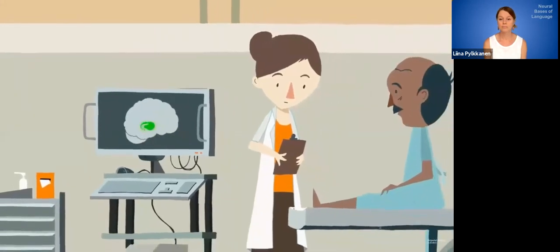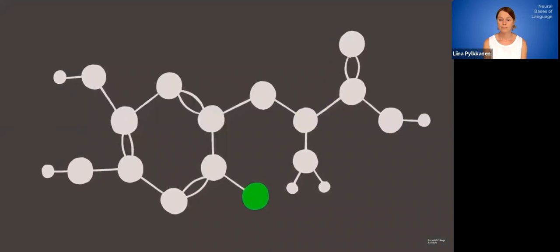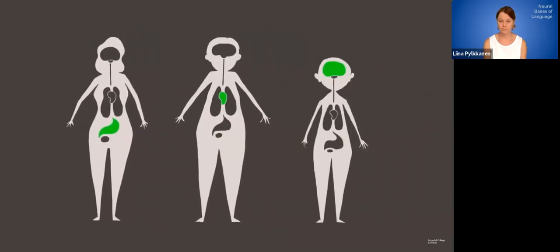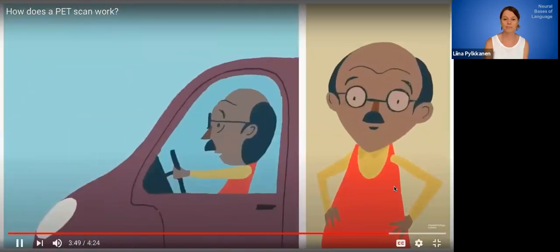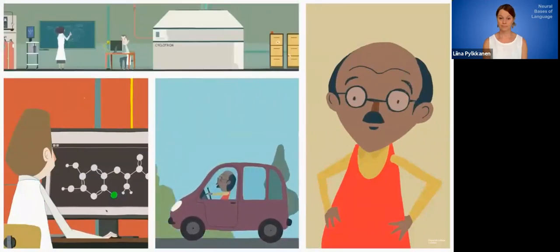For Dave, it was just a small injection. That wasn't so bad, huh? All made possible by the incredible technology of the tracer. The potential for PET is enormous. Different tracers can detect cancer, test heart function, and even track Alzheimer's. The PET scan has revealed Dave's brain is functioning as it should. Dave, you're A-OK. In the next hour or so, his radioactivity levels will be back to normal. It's another successful job for the incredible tracers. But the work of Dr. Miller goes on as he continues creating new tracers to help those in need.